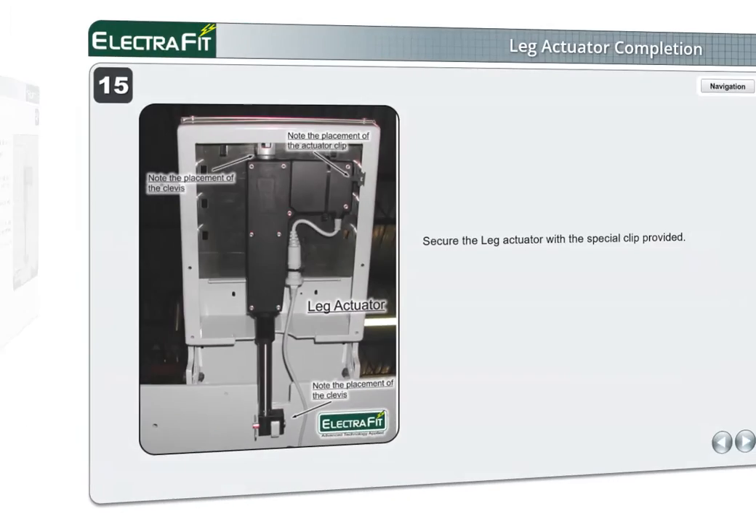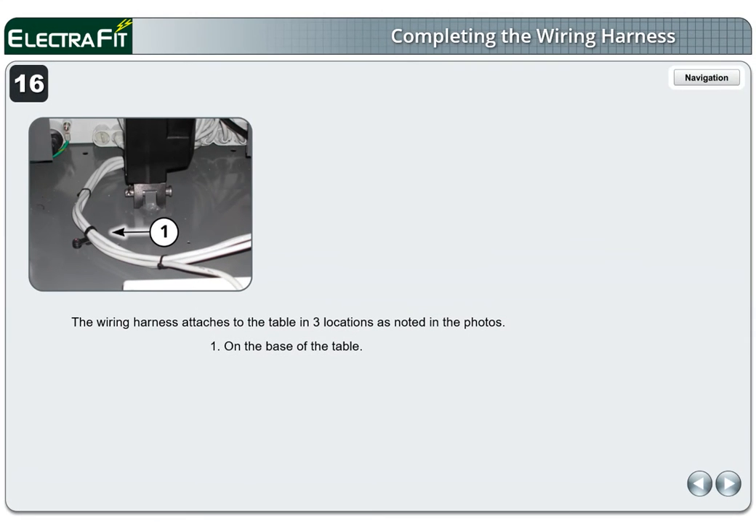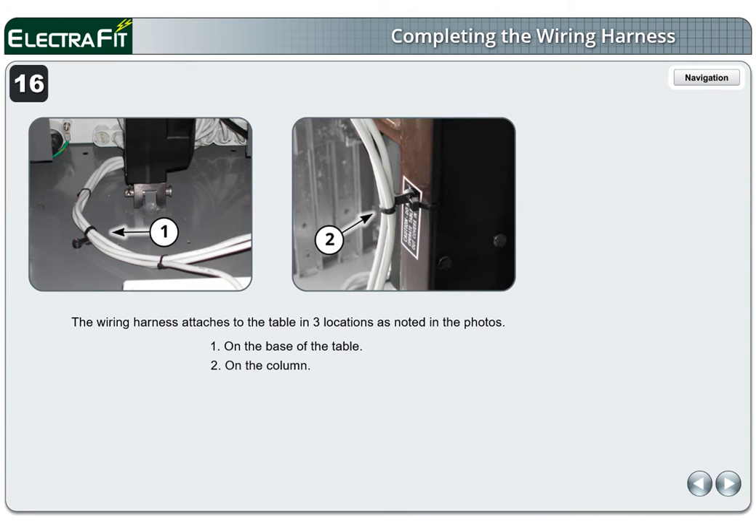Page 15. Secure the leg actuator with the special clip provided. Tighten the set screws. Page 16. The wiring harness attaches to the table in three locations as noted in the photos: 1 on the base of the table, 2 on the column.